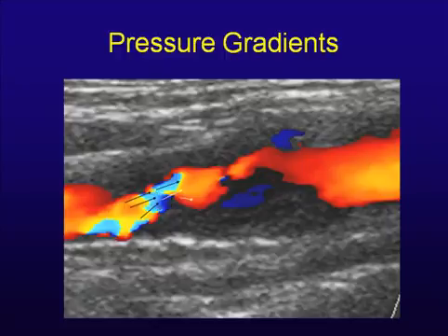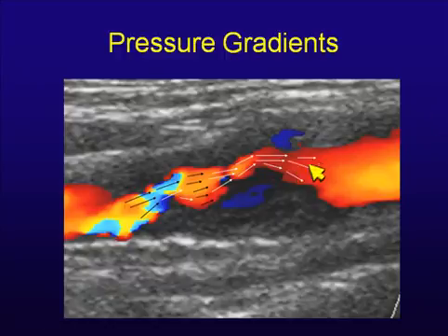So now we'll sample it there. It's now getting wider in this position, so it's slowing down. We'll have samples there. Now it's narrowing again. It's speeding up. It's still speeding up. Now it's spreading out again, slowing down. Now it's slowing down because we're going further, and there now we're into the normal blood vessel, and so now we've got all the velocities sampled across that stenosis.